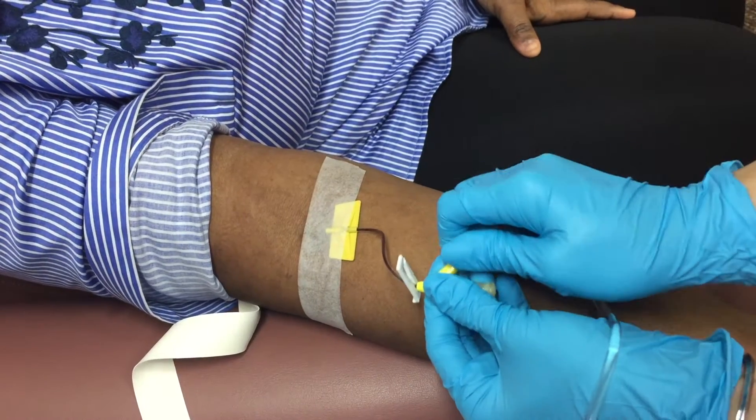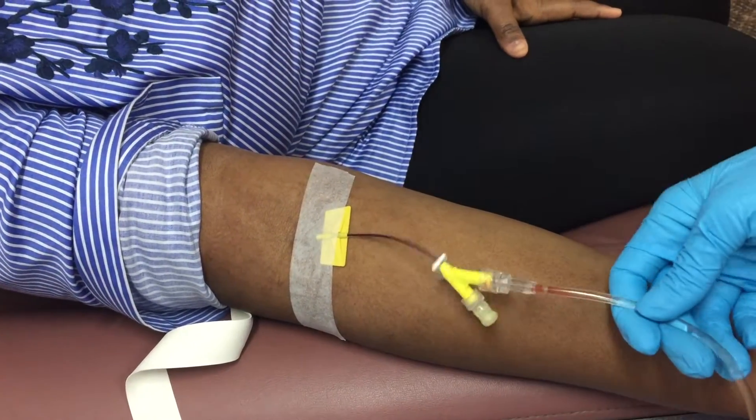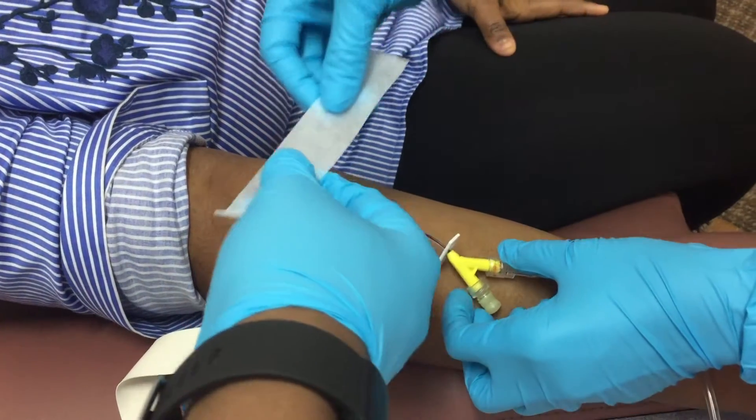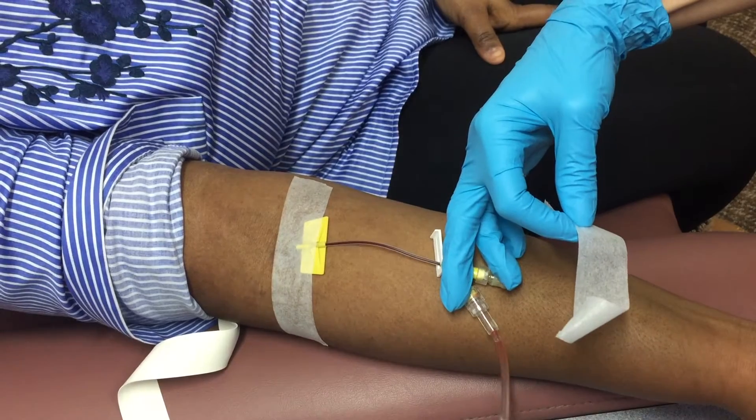At this point, make sure to communicate with your patient, asking about any burning sensation or checking for any swelling around the insertion site. If none of that is happening, you're all good to go.